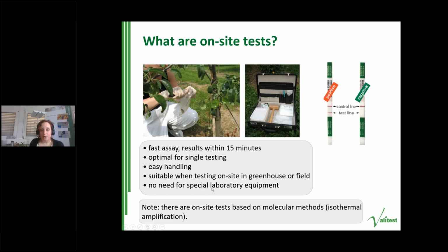There is no need for special laboratory equipment. You see here how a field inspector got organized, so he has everything ready to perform a test in the field. Please note that there are on-site tests based on molecular methods as well. They are based on isothermal amplification, but today's seminar is restricted to on-site tests based on serological methods.